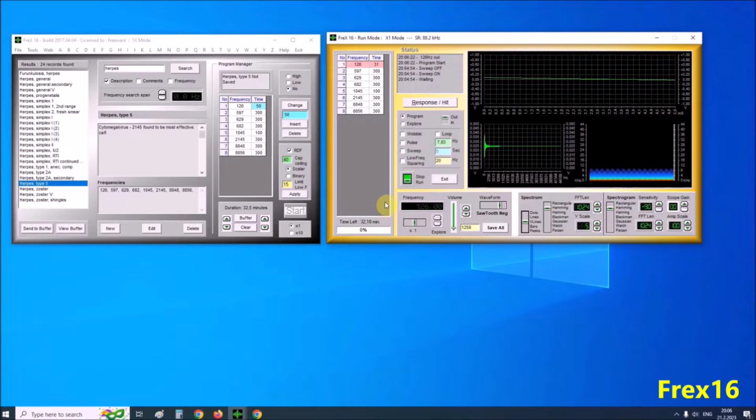As time passes, the elapsed frequencies turn red. And at the end of the set time, the generator is automatically switched off. In our case, after 31.92 minutes.